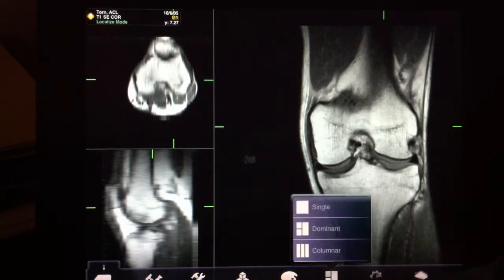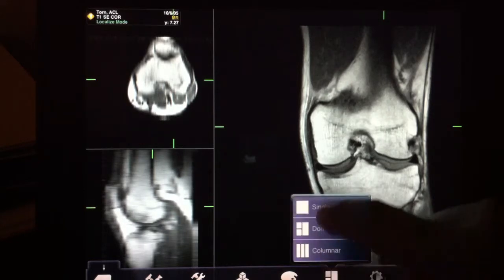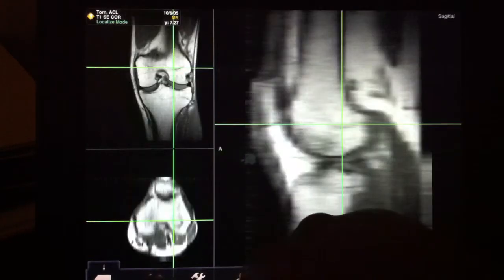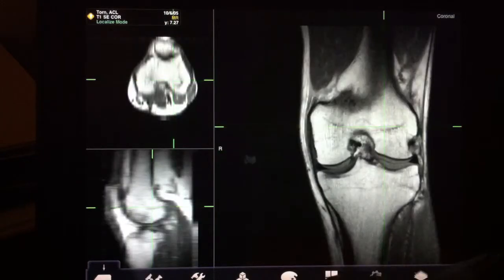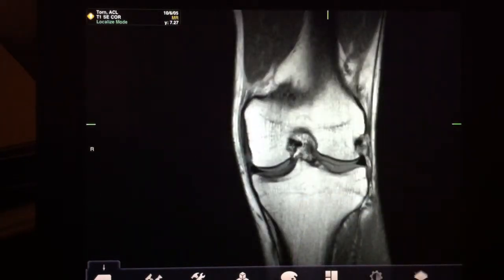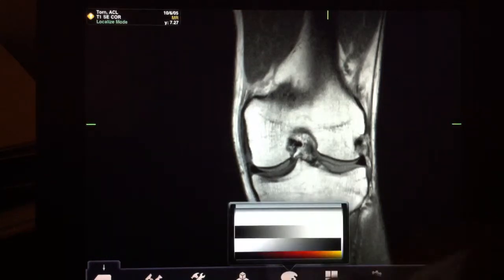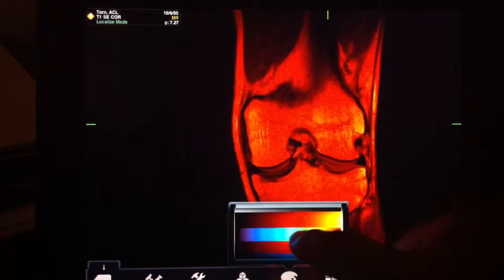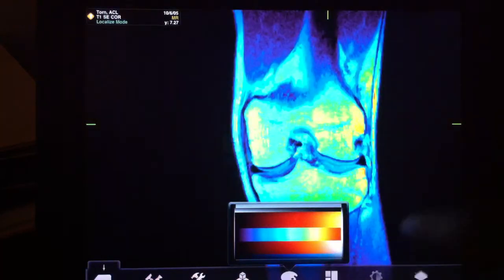You can change which of the three views is in the dominant position by rotating through like this, and you can go back to the single mode we started in. You can also change the color panel, so you can have a color lookup table of your own.